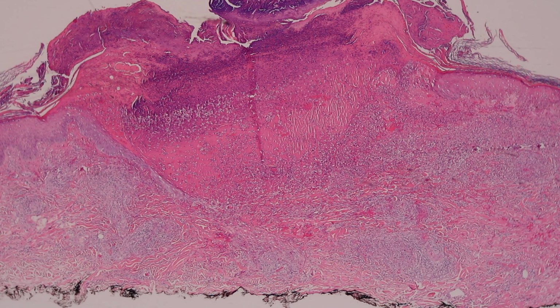So one thing that we've taught our residents that you can do in a pinch is to do what we call a double punch. So you do a punch biopsy down all the way as deep as you can into the dermis, pull that little core of tissue out and snip it and put it into the specimen bottle, and then go back into that same hole that you made with the first punch and use the punch tool and go down again deeper into the underlying fat and pull that up and snip that and put it into the same jar. And then you can just put on your requisition sheet that it's a double punch, in an attempt to get the subcutis.